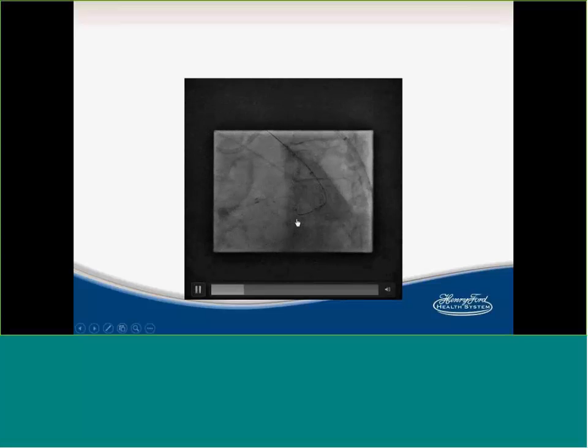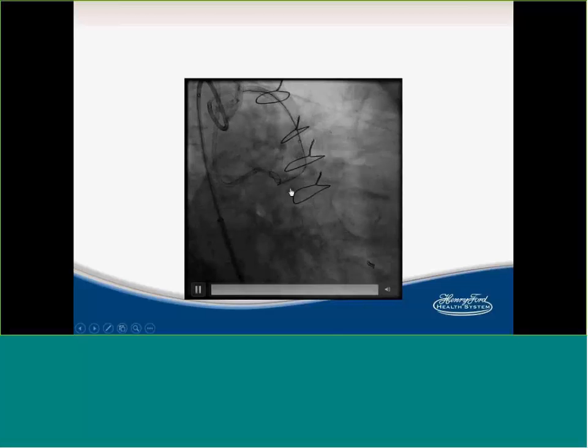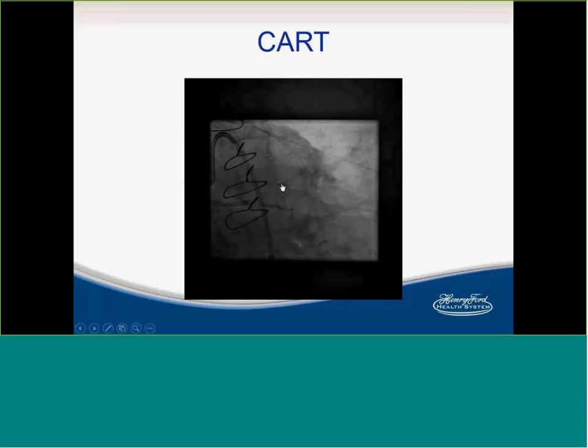Yeah, and look at this. Here, I'm just pushing a knuckle. I just want to destroy the whole thing, but I made sure that my knuckle does not actually destroy my circ. So I pushed the knuckle, and the knuckle went all the way to here. See it? So this is the knuckle. And over the knuckle, I actually advanced a retrograde balloon through the graft. This is the guide liner all the way almost to the end of the graft, outside balloon, and I crushed from the outside.